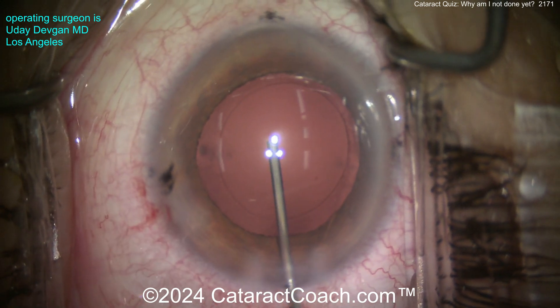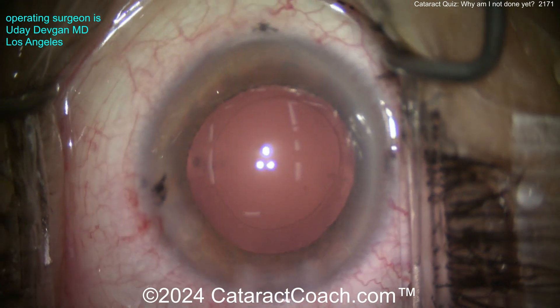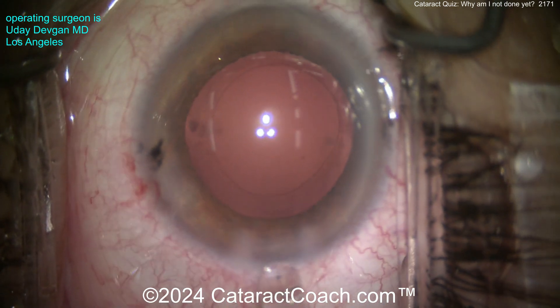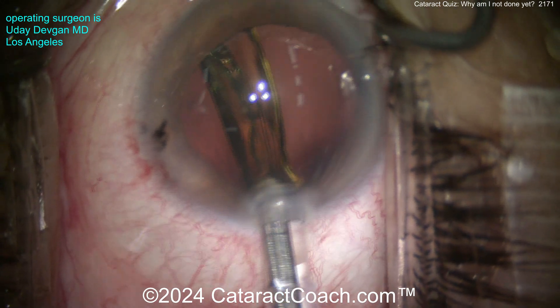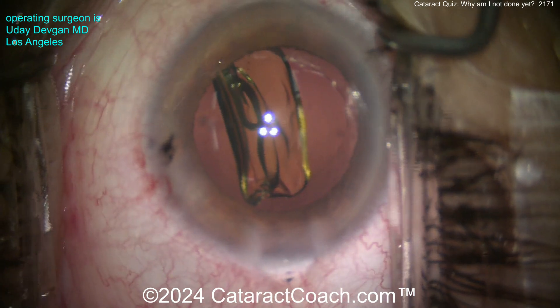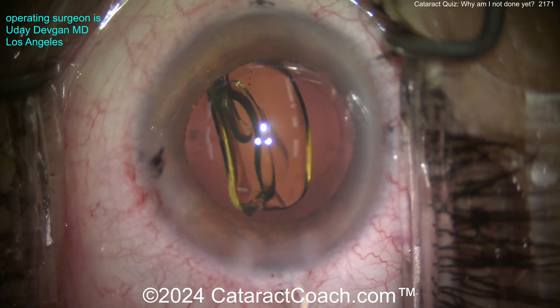End of the case — nice looking capsulorrhexis. Put some viscoelastic, get that bag nicely expanded, and now I'm getting ready to put the lens in. Here comes our lens — it's going to be a single-piece monofocal acrylic lens with a toric design. There it goes into the capsular bag pretty nicely.